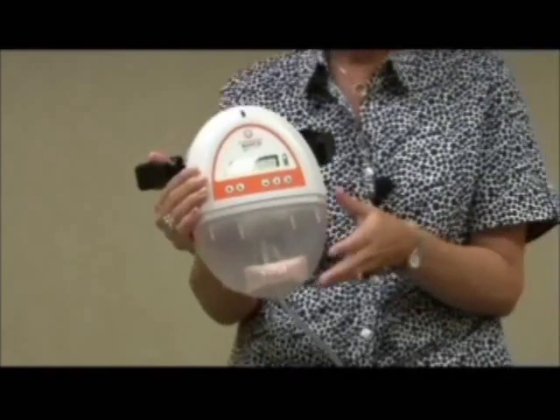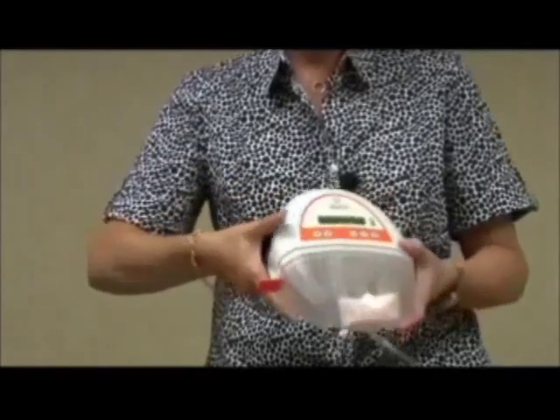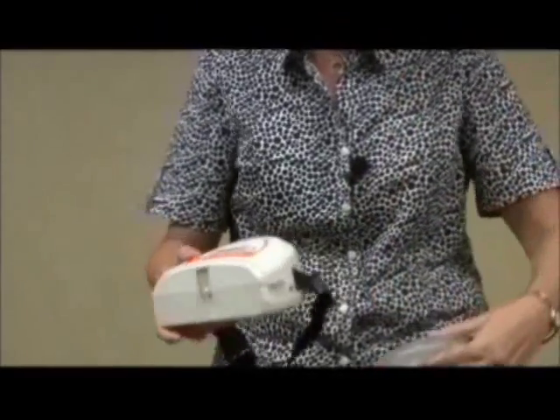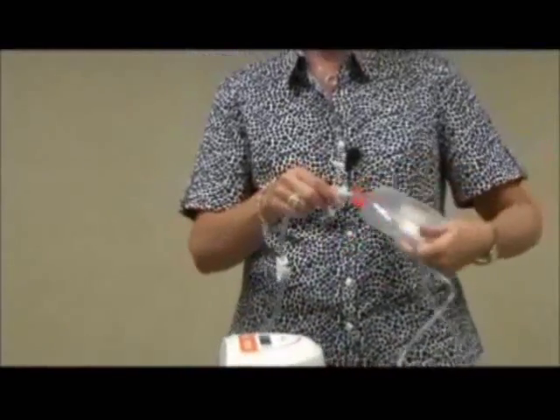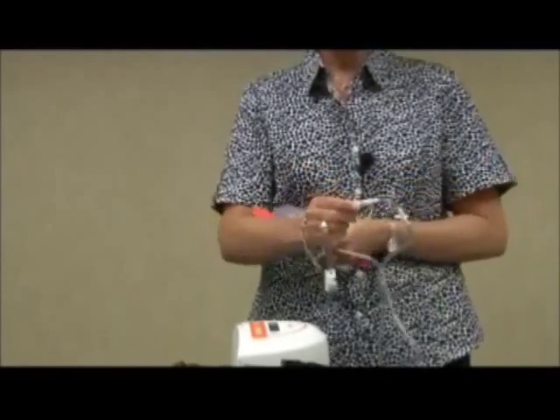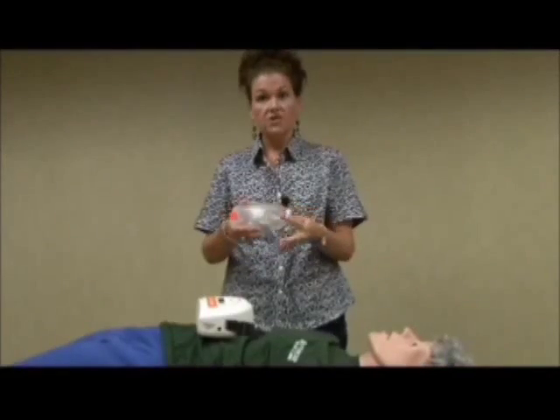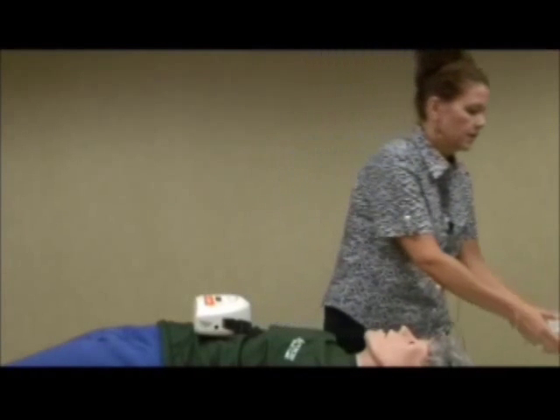You can safely change your canister by reaching to the side on each side, releasing the orange clips one at a time, and then removing the canister. This canister can be disposed of in your regular trash. You'll disconnect the canister from the tubing to the dressing by pressing the orange clips on each side and pulling the two pieces apart. Once you've disconnected the canister, you're safe to throw this into your regular trash can.